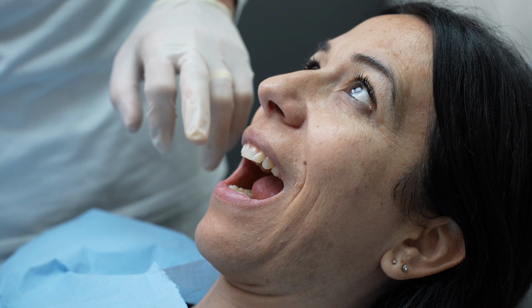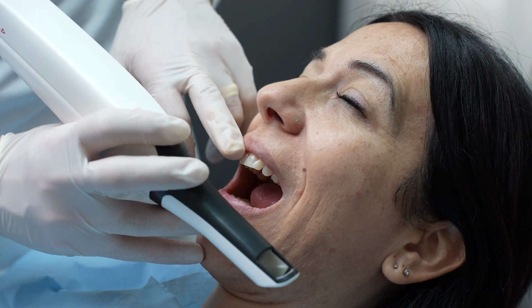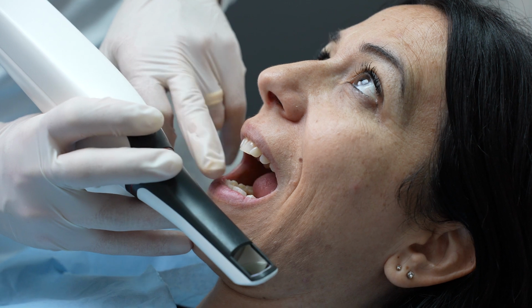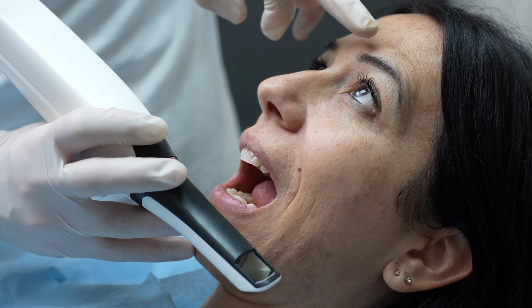Well, the position of the lips is not very important because it will surely be different than in the facial scan. The important thing will be the palatine dental arch in the inner part, the nose, the wings of the nose, and part of the forehead that will be needed by the lab.